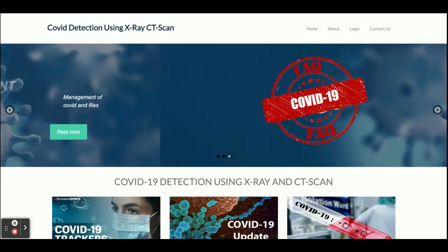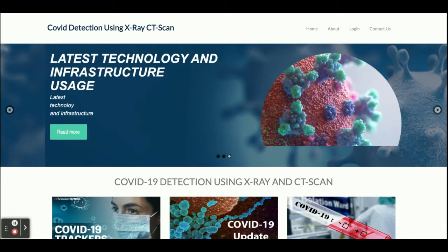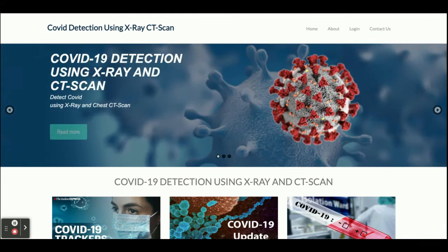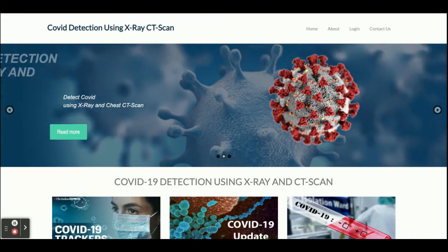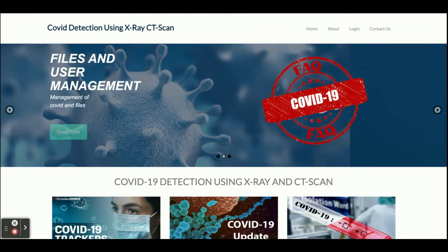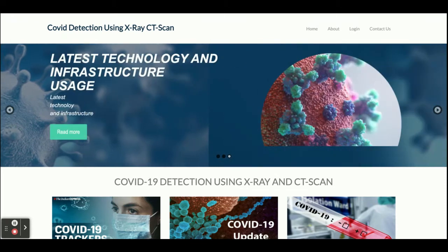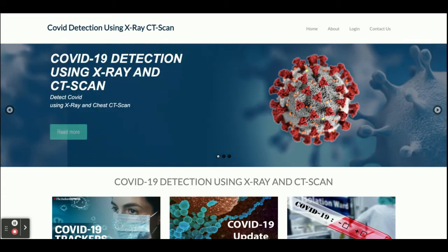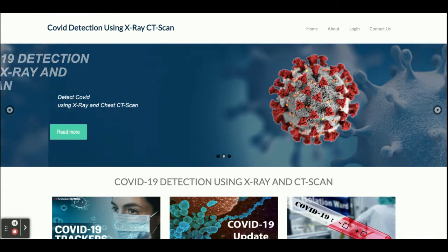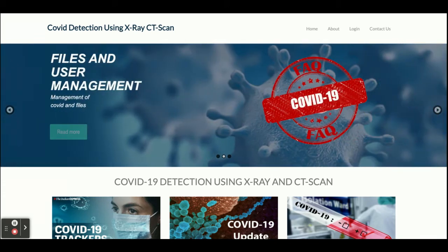This is a machine learning project and I have used four types of models. We have already trained models and we are using those models for checking the X-ray uploaded by the admin, and the CT scan uploaded by the admin. This is a very relevant topic in the current scenario.